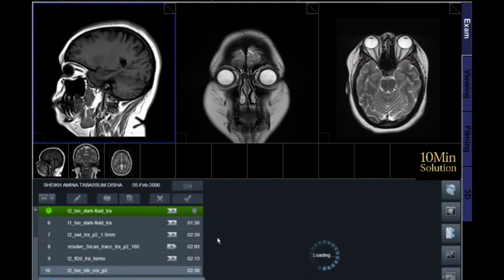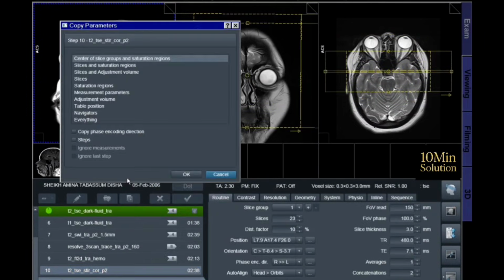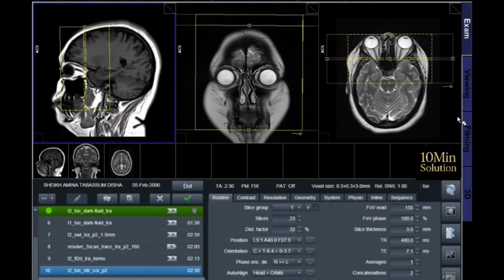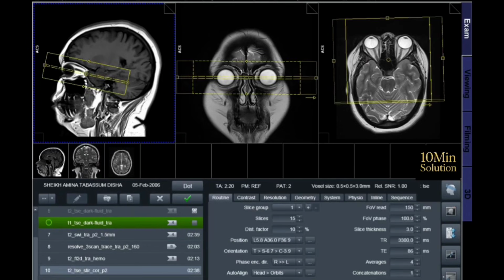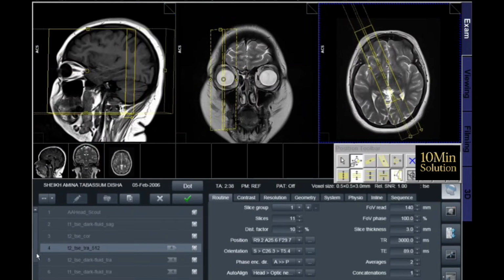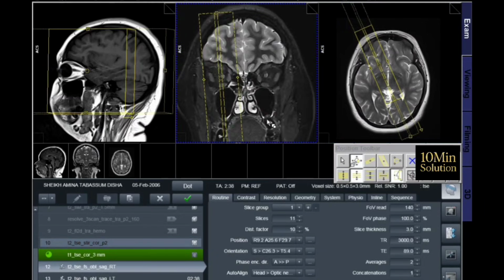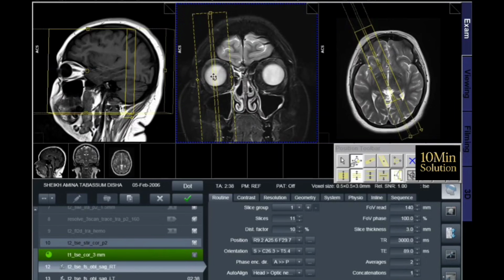Axial brain images are planned parallel to the AC-PC line. Coverage should extend from the foramen magnum to the vertex. The typical slice thickness is 4 to 5 millimeters, with minimal or no interslice gap. Axial images provide excellent visualization of the brain parenchyma, ventricular system, and basal ganglia.